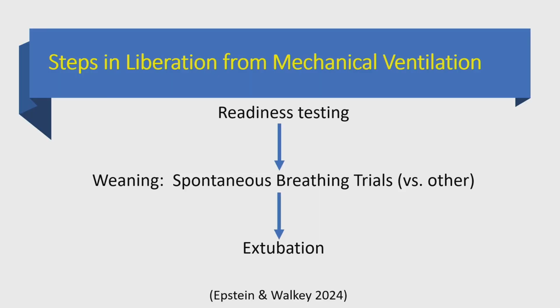My goal is to give you a much more practical, granular, close to the patient type of a talk. There are basically 3 steps to liberation from mechanical ventilation. First one is readiness testing. Recognize who's ready for a trial of liberation from mechanical ventilation.